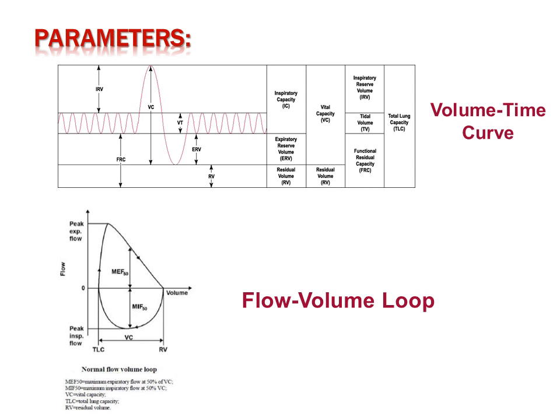So clinically speaking, most spirograms rely on the flow volume loop in assessing diseases. So you students should be very familiar with the flow volume loop, and you should understand every detail of this loop, and you should know every parameter and how it can be evaluated clinically.